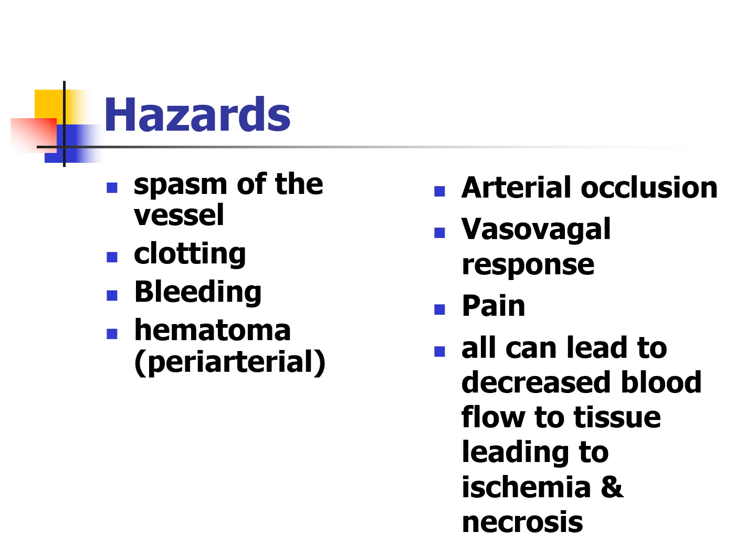And of course, one of the most common ones is going to be a bruise, a hematoma that shows up. That bruise can easily show up, especially on your generationally advanced individuals. All of those patient populations will have the bruise show up because their skin is just not able to clot off as fast. So bruises are very common, it's a very sad thing, but it's actually one of the more common hazards that you'll still see.